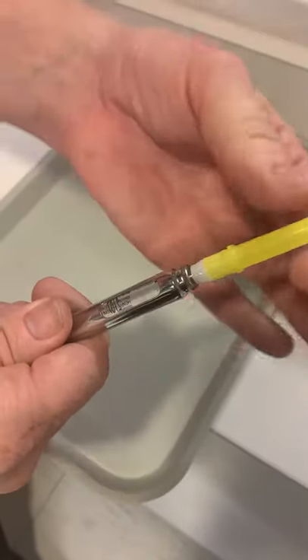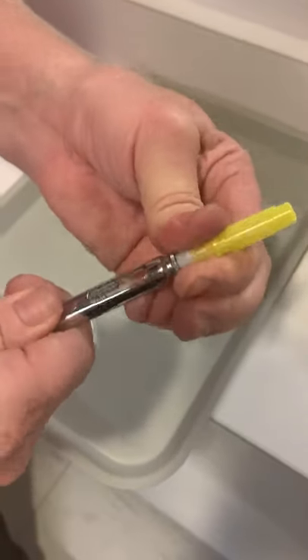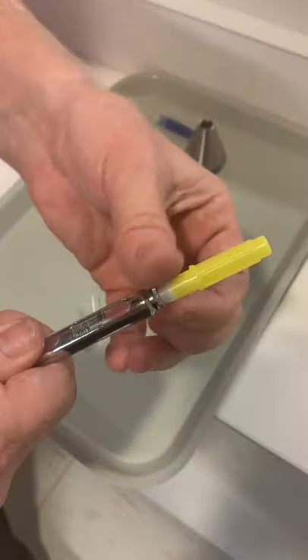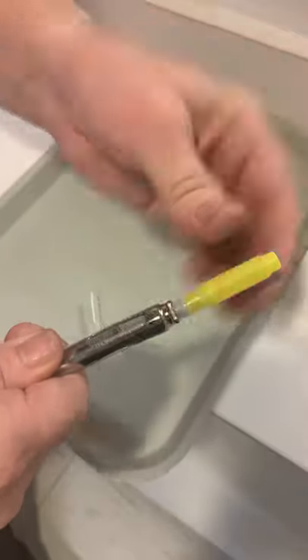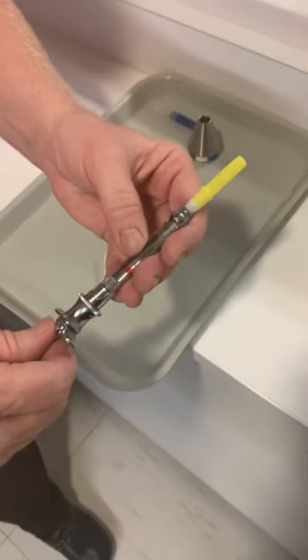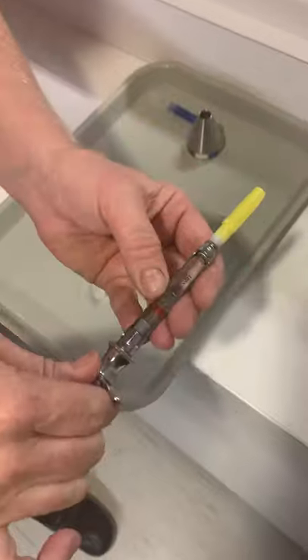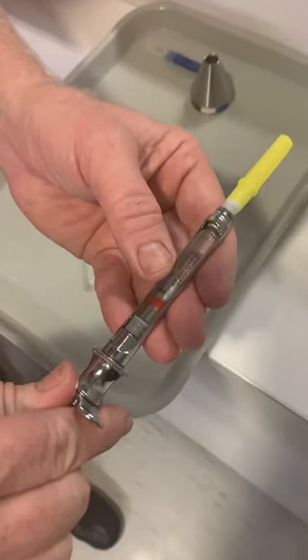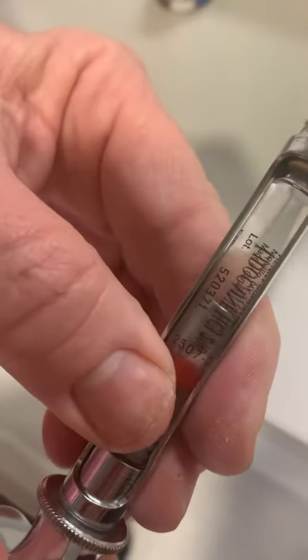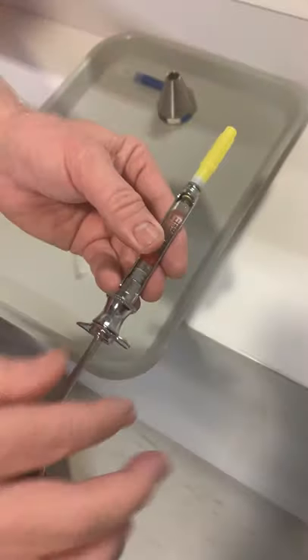If you only twist the cap, that can come off and you can poke yourself. Push down and twist — you can do it this way or this way, but not just the cap alone. Also make sure that everything is in line to pass it, and that the expiration date is showing for the doctor.